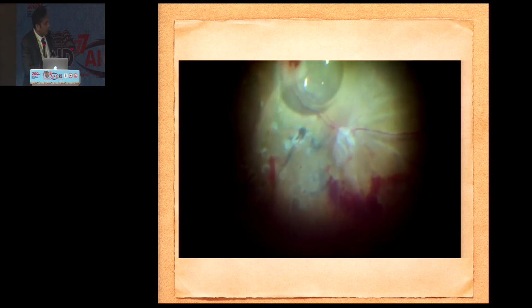Doing excess cautery is not recommended, especially if the proliferations are near arcades. PFCL can act as a good temporary tamponade to control intraoperative bleeding. You just have to put a bubble and roll it where you are doing the trimming. So it acts as a good hemostasis agent.